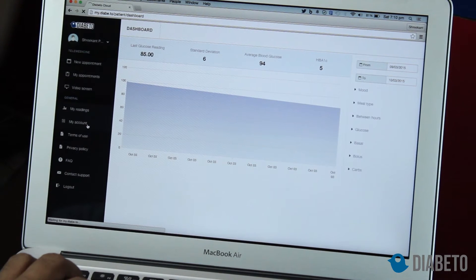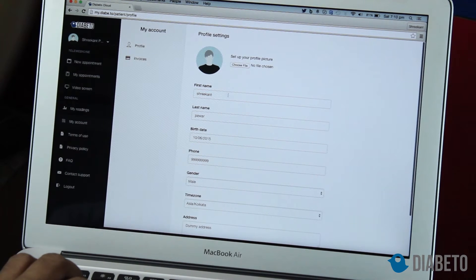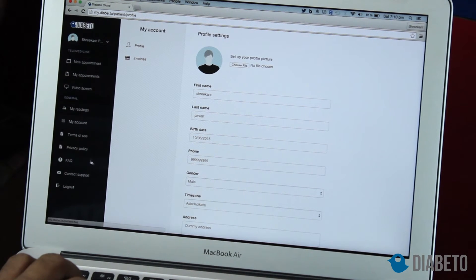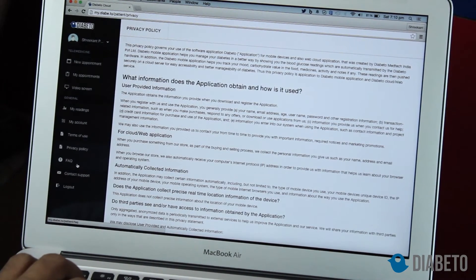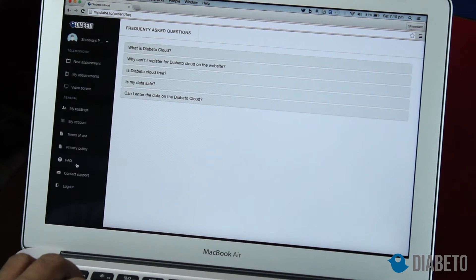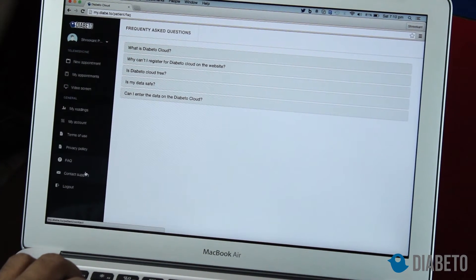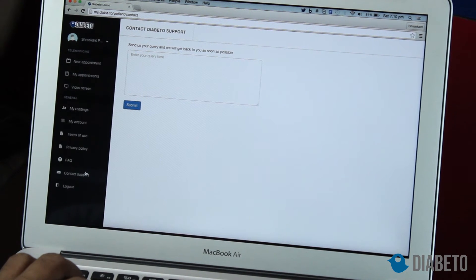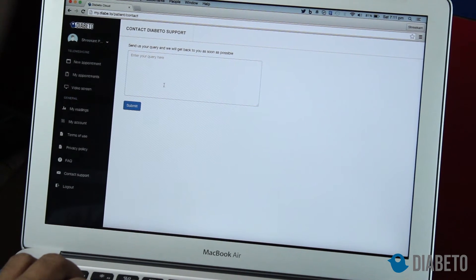In the account section you can also view invoices once you have started taking teleconsultations. There are the terms of use and privacy policy which you agreed to when creating your account. Frequently asked questions can also be found here, and if you have any issues during beta testing or using the Diabito cloud, you can send us a query which will come straight to us.